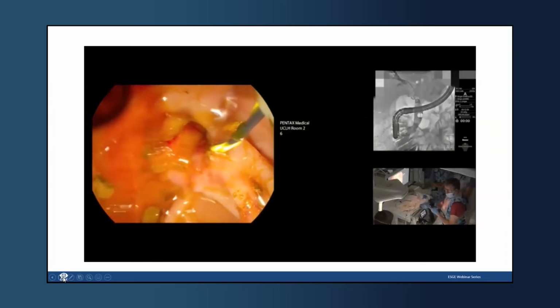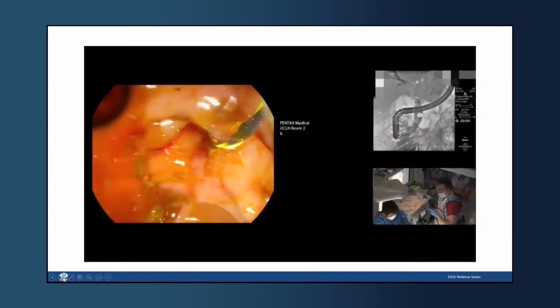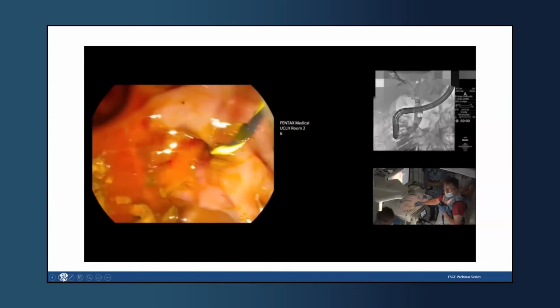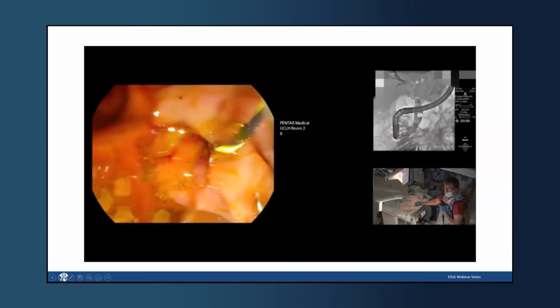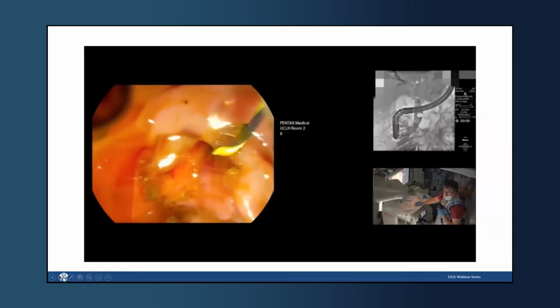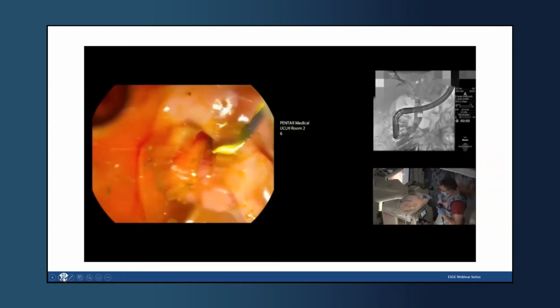Anastomotic stricture, I think, does need more management. And so we're going to insert a 4 centimetre by 10 millimetre CAFIS stent, which of course is a fully covered and therefore removable mesh metal stent that is particularly of use for high and benign anastomotic strictures, particularly post-transplant actually. And the other members of the faculty may want to comment further, I know.